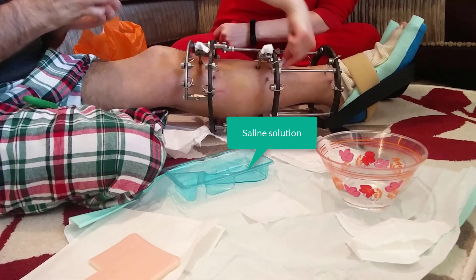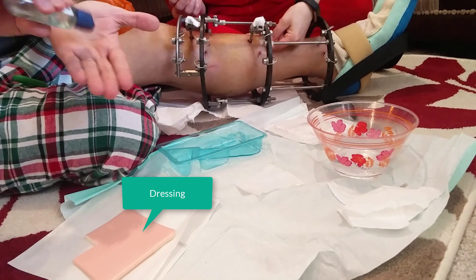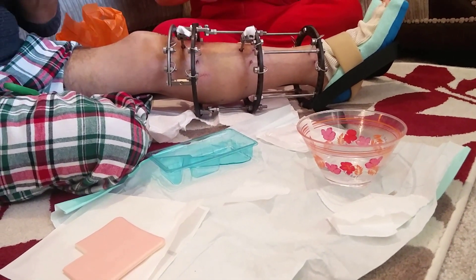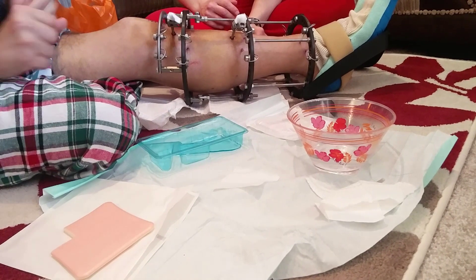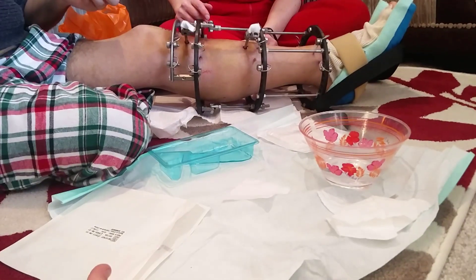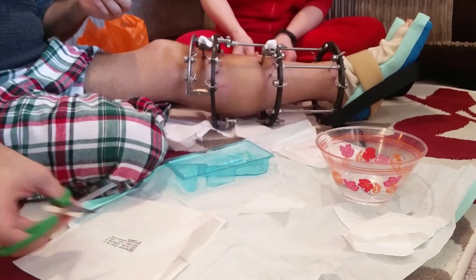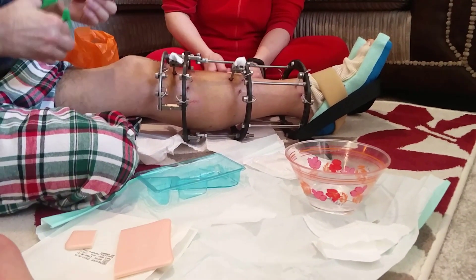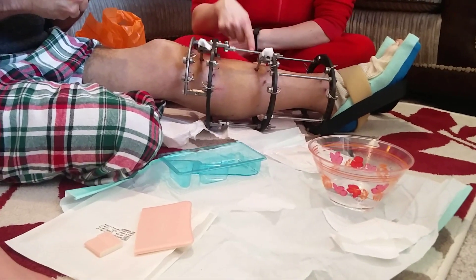The nurse applies antibacterial treatment, one per pin. I'm quite squeamish but actually I'm not too bad right now. Last time I thought I was going to faint, but I've got used to it. One of the pins is a bit gunky and still needs to be cleaned.